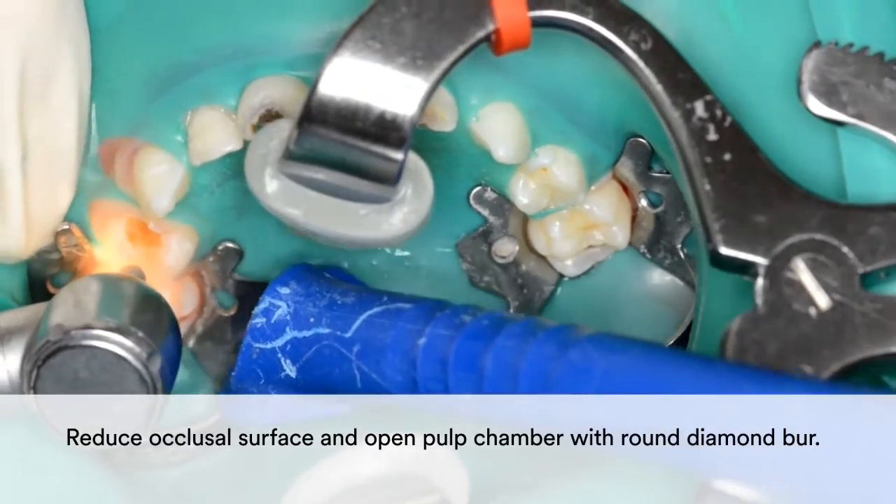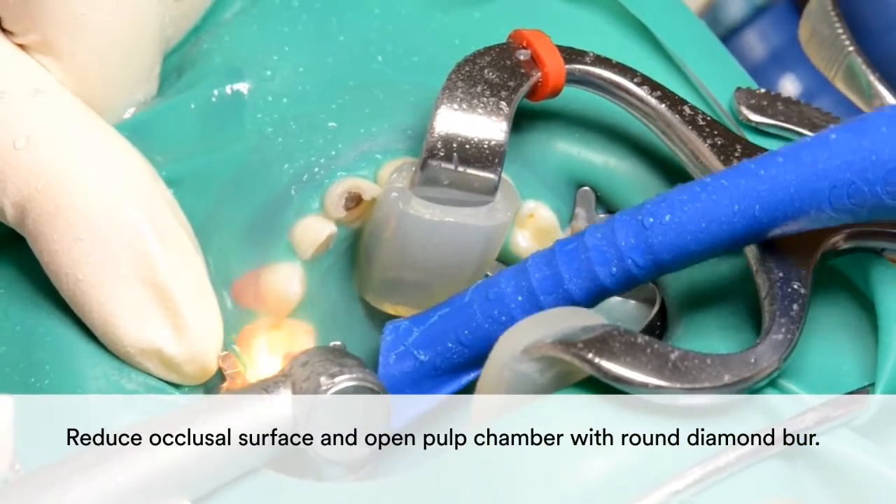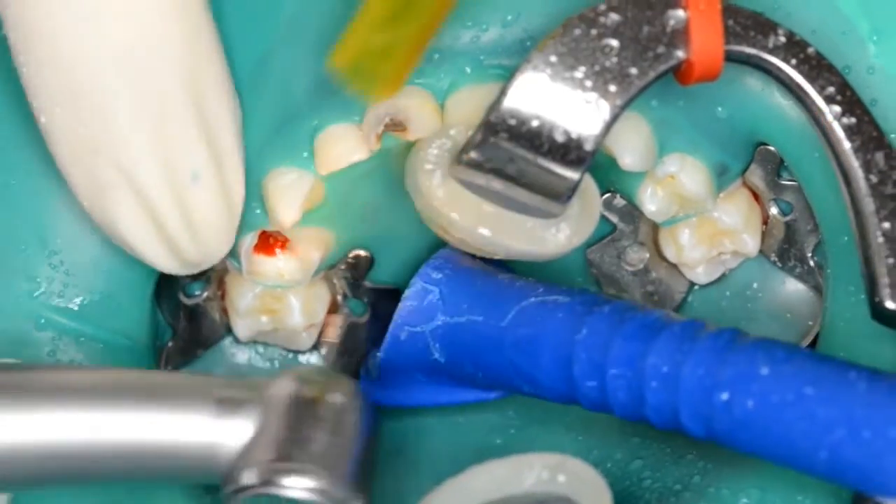In this case, the dentist determined that pulp therapy was necessary. When faced with that situation, reduce the occlusal surface and open the pulp chamber with a round diamond burr.